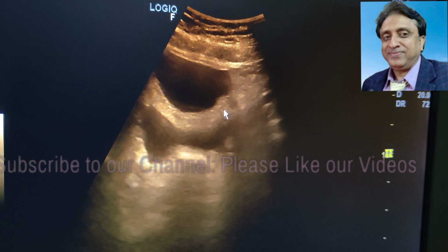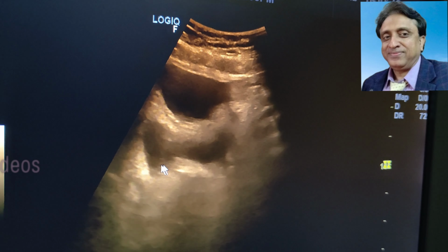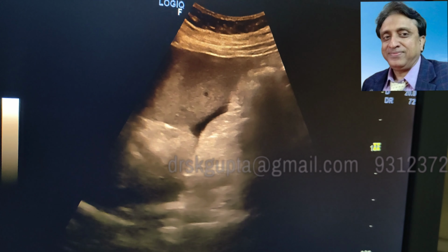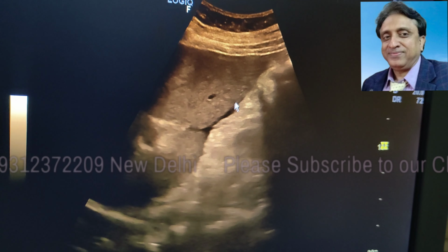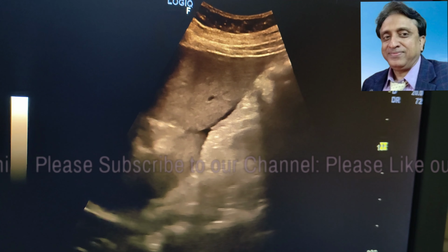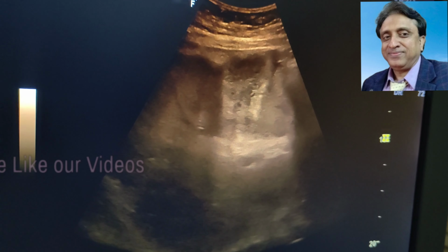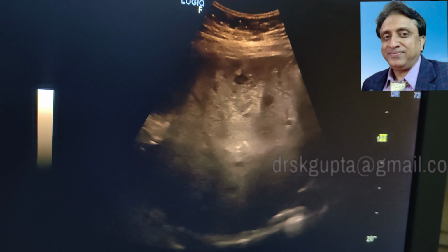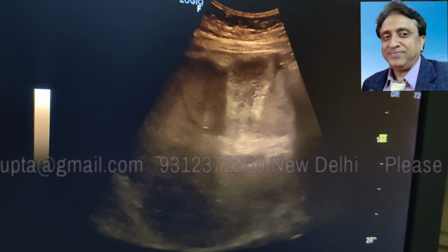This is the urinary bladder of the patient, and you can see that there is some fluid in the retrovesical space, suggestive of ascites in the pelvis. This is the liver, and you can see there is some fluid collection in the space below the liver, and if I look, I find there is some fluid in Morrison's pouch, and Morrison's pouch is the most dependent structure of the abdomen, and the fluid collection generally starts earliest.